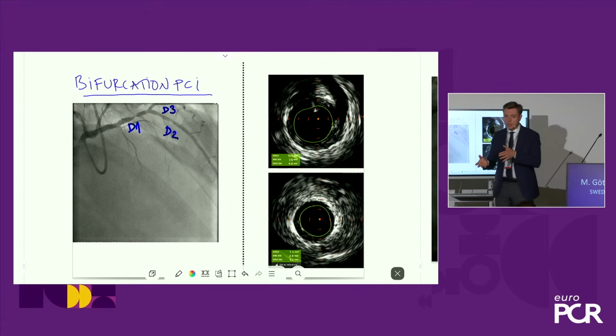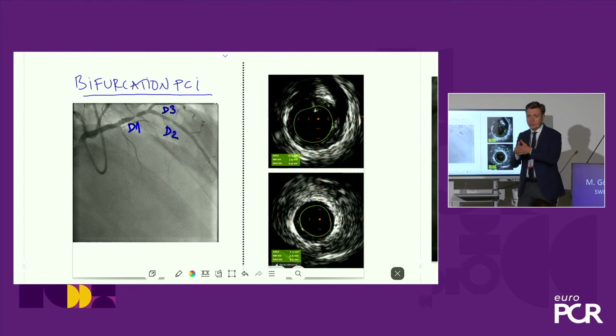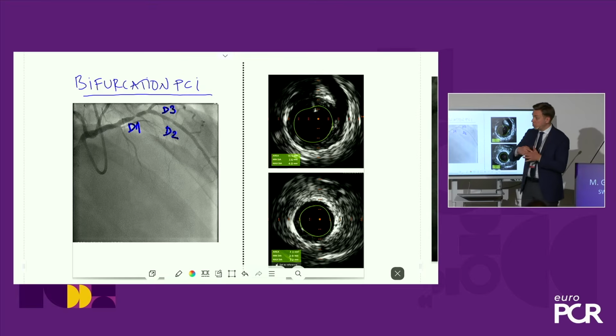Now, using the boosted image, the enhanced cath lab image, helps you with the proximal edge very much. But if you want to be very precise at the ostium of the side branch, then it's a question. Of course, you can use the wire, but depending on the size of the side branch, it could be very large. So I think what comes in handy here is, from the first presentation, you saw a diluted contrast.